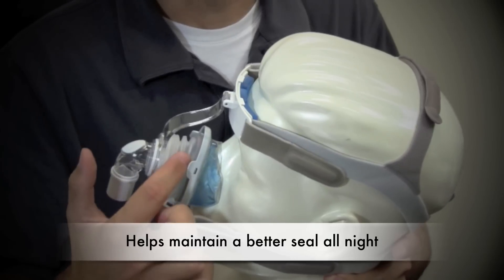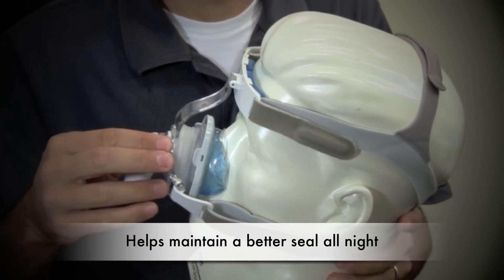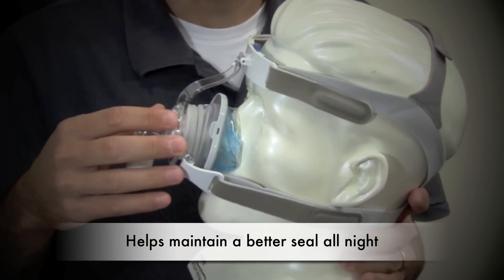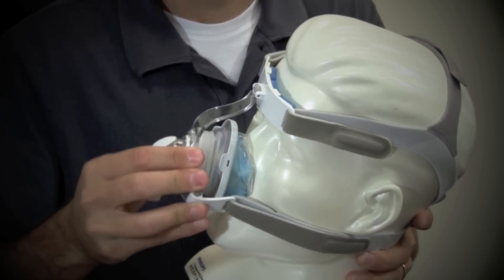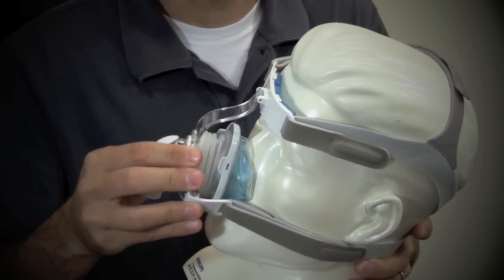Notice this spring in here. This is the free-form spring. It allows you to move in any direction while maintaining a good seal. There's a lot of margin of error there in case you move around a lot.